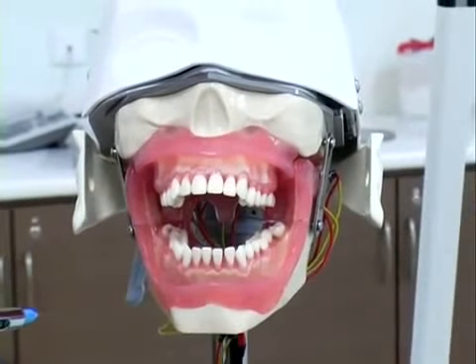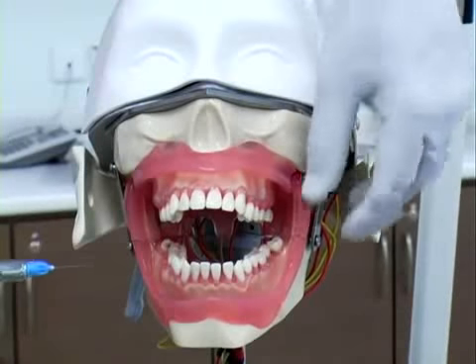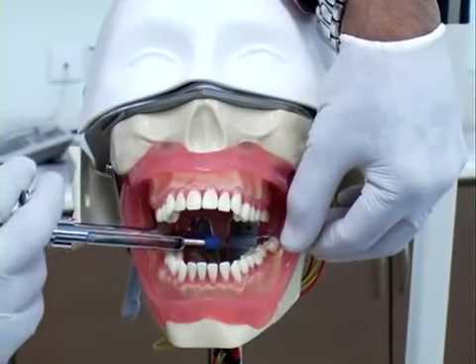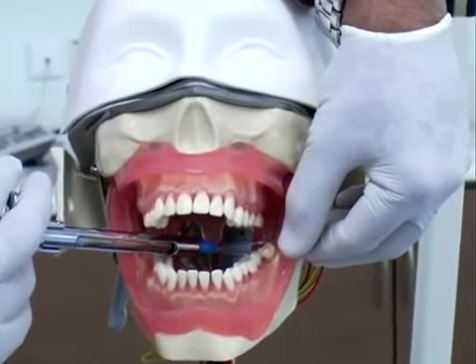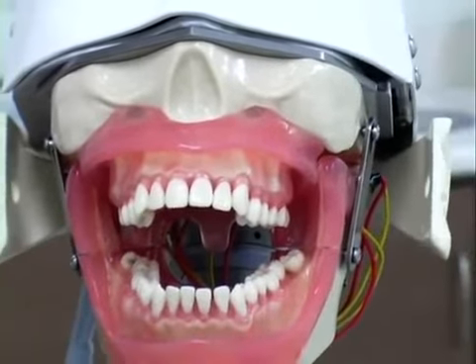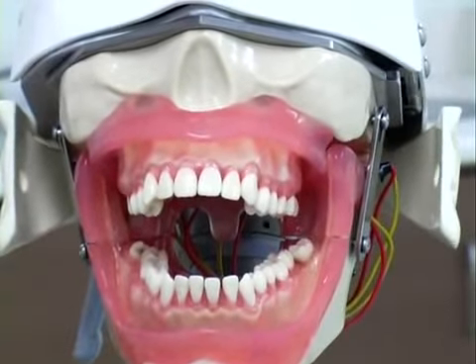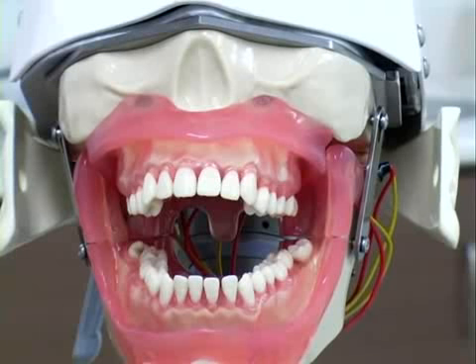We are also going to demonstrate the block of the lingual nerve, which is slightly medial to the lower wisdom tooth, and by depositing a few mils of the local anesthesia in this area, you can easily block the lingual nerve.